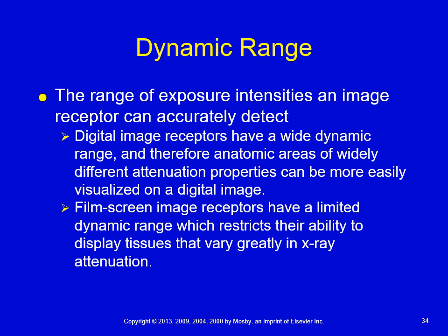When you're working with techs, you'll notice that some change technique, some dial it in, meaning they select the body part and they use whatever pops up, or they use the AEC, and some you'll notice that whenever they start imaging, they change their KVP or mAs. Now, when you see them change their KVP or mAs when you're out in the real world, what I do want you to do is note those changes in your mind or in your little notebook.